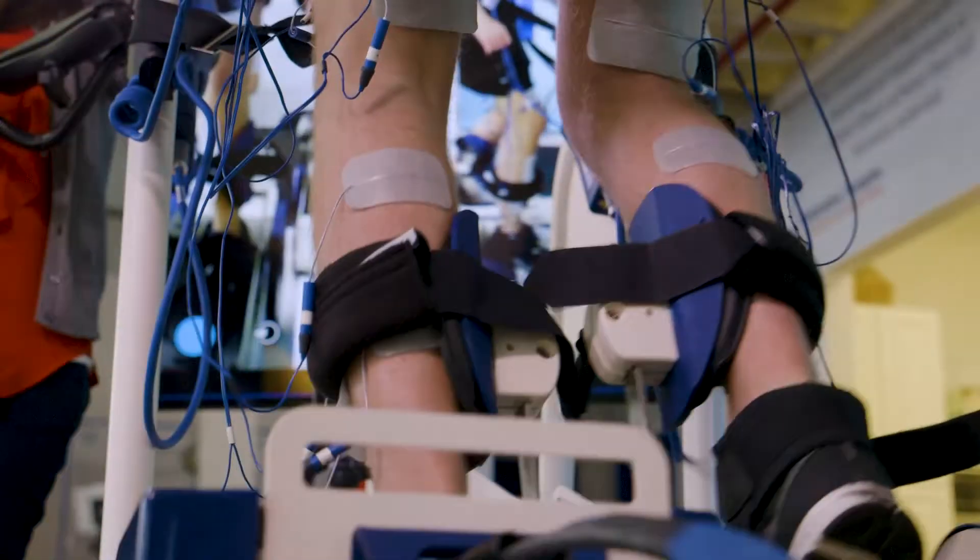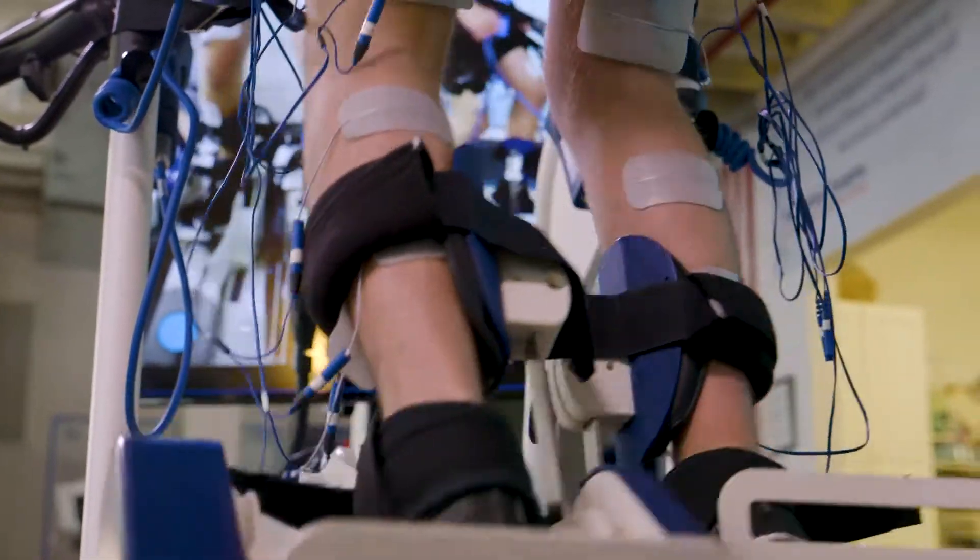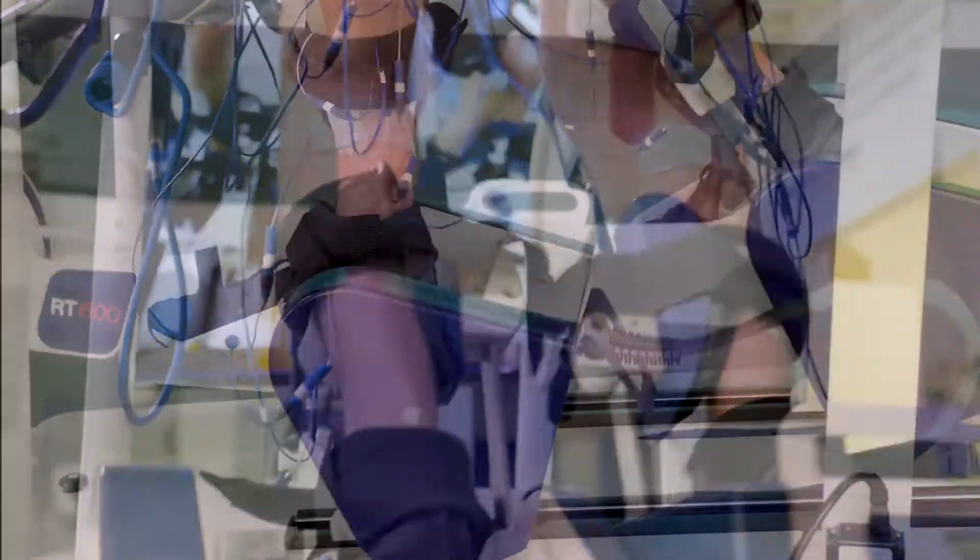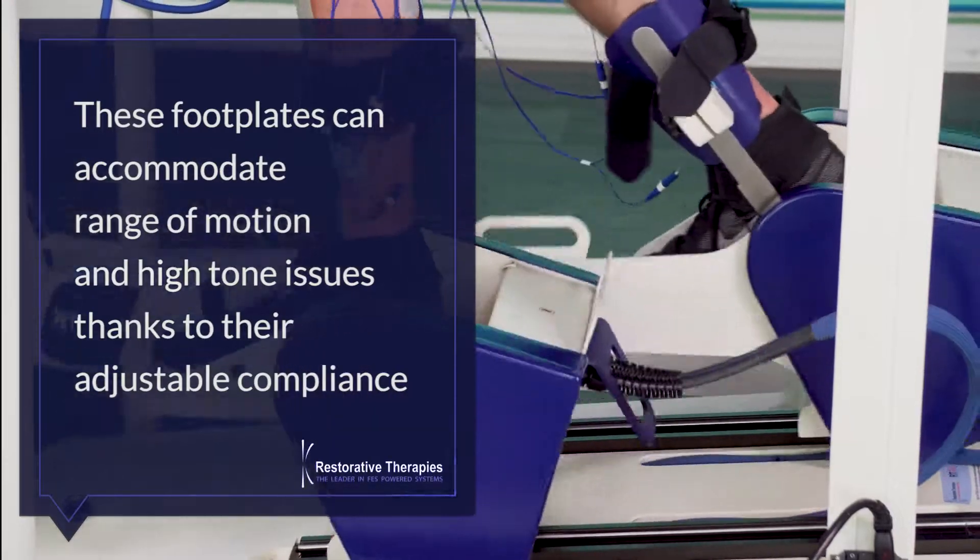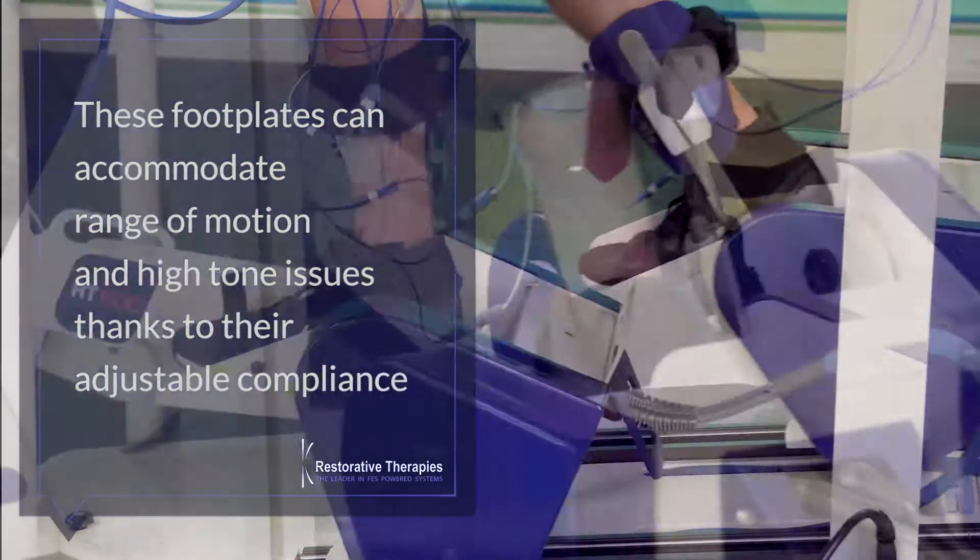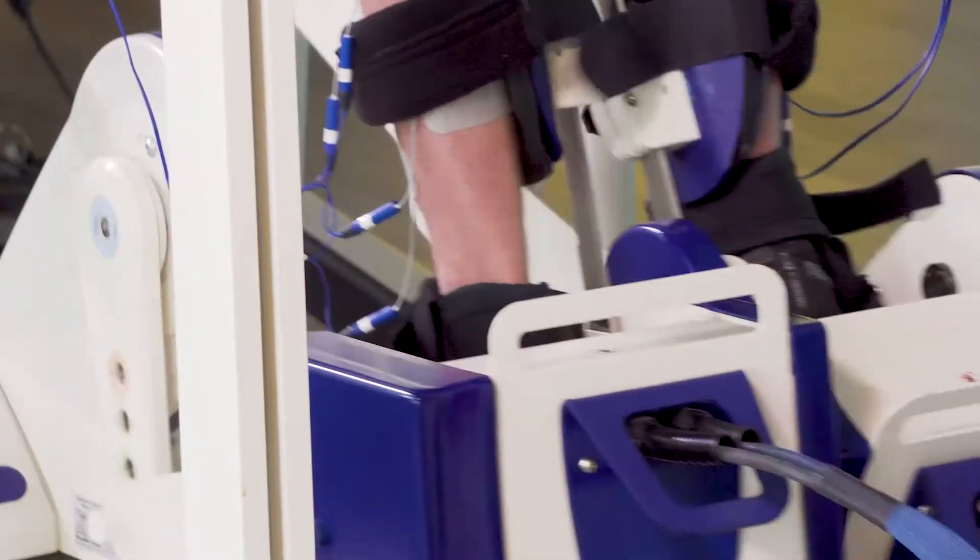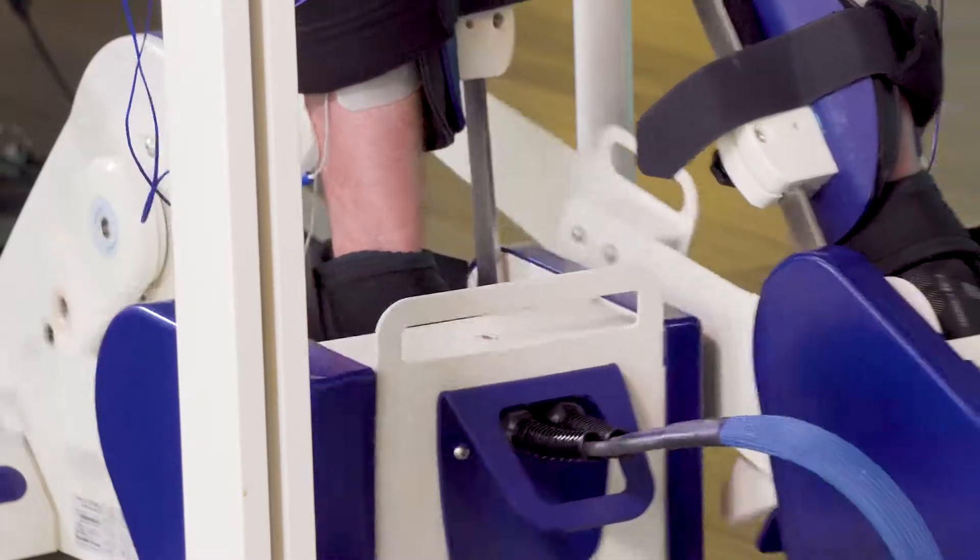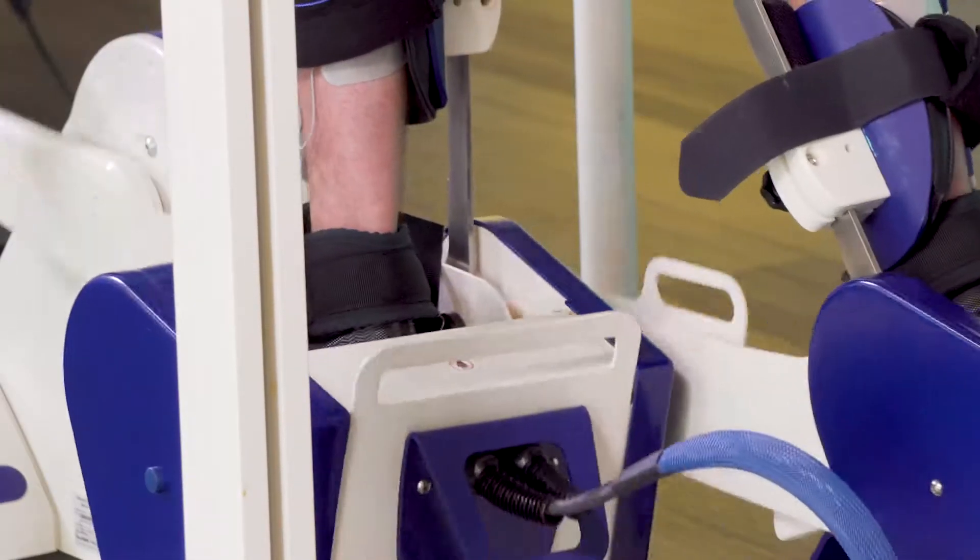Parker's feet are safely positioned in the robotic footplates that mimic normal ankle motion. These footplates can accommodate range of motion and high tone issues thanks to their adjustable compliance. Parker's footplate firmness will automatically increase as his tone relaxes throughout the stepping session.